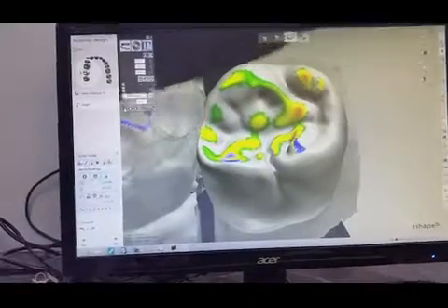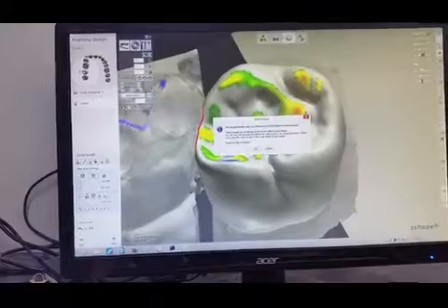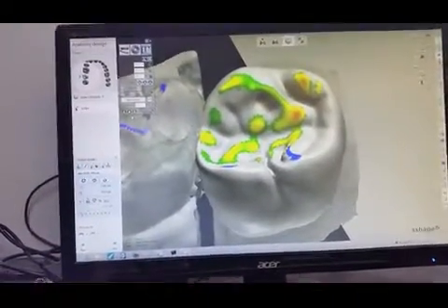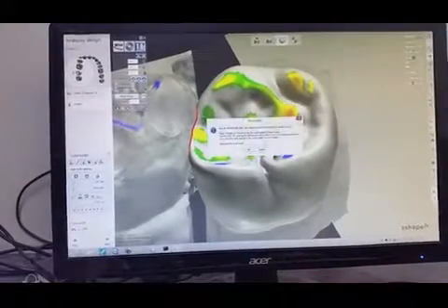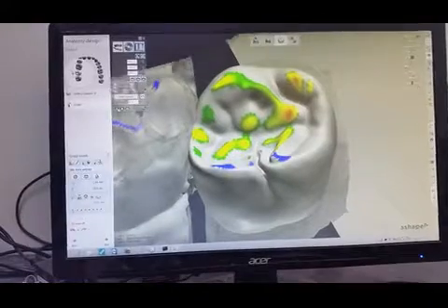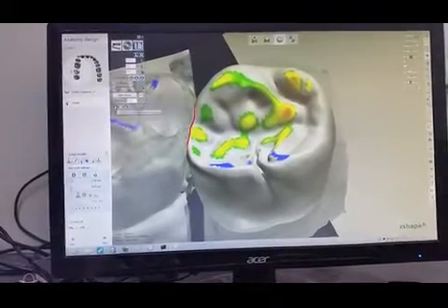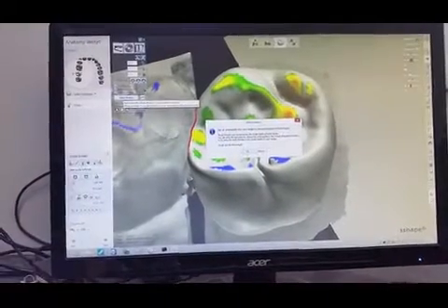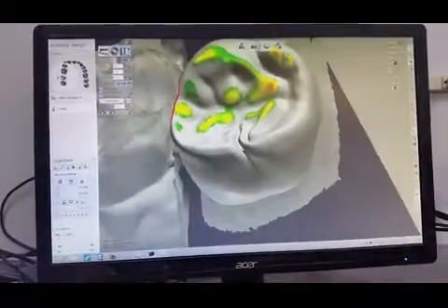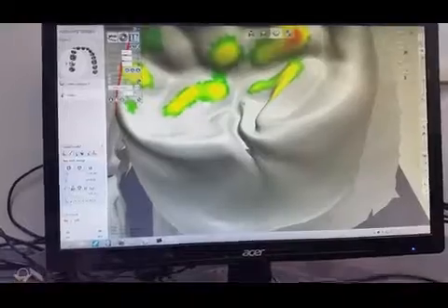We're going to do it again. We have a little bit. We're going to clear that. We're going to do it again. We're going to keep doing it till we actually clear lateral movement altogether. And as you can see, it kind of distorted the contour of the crown.